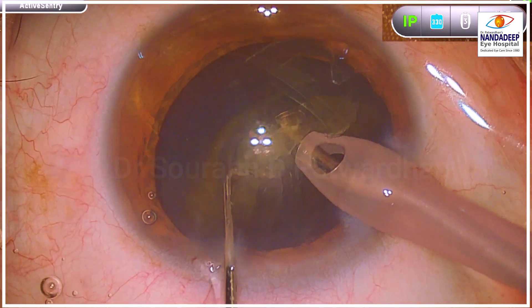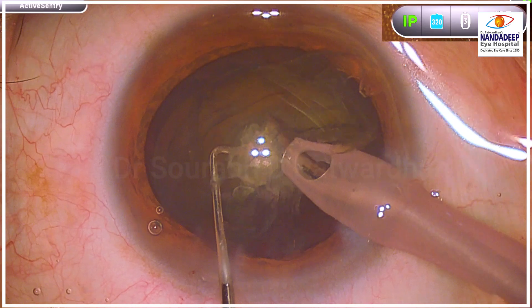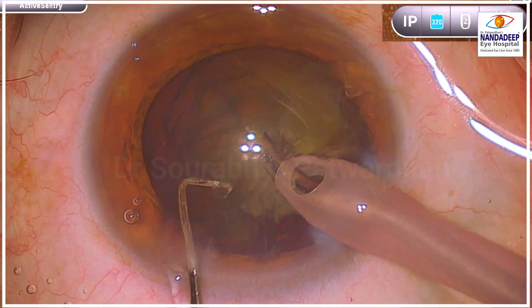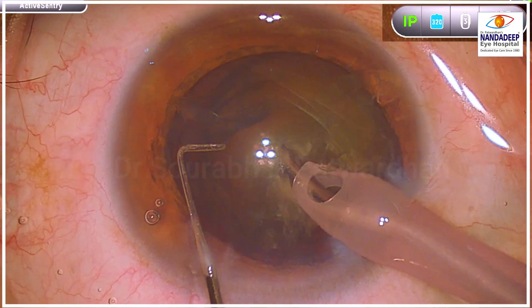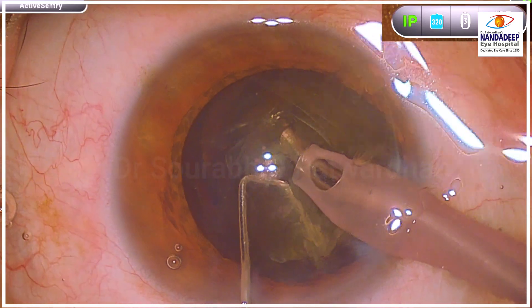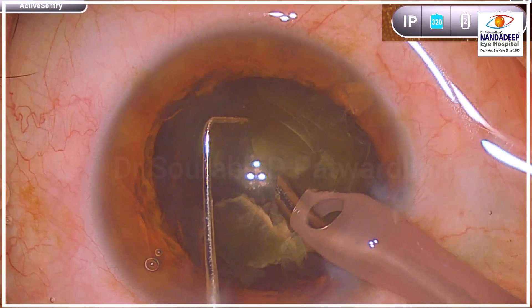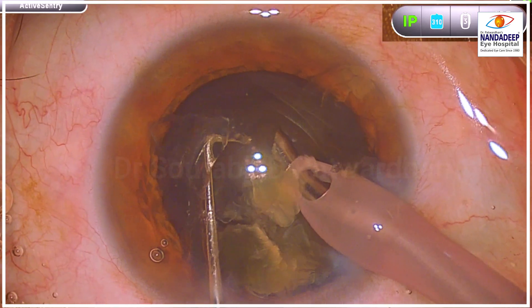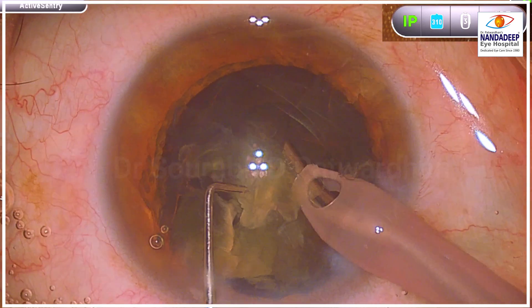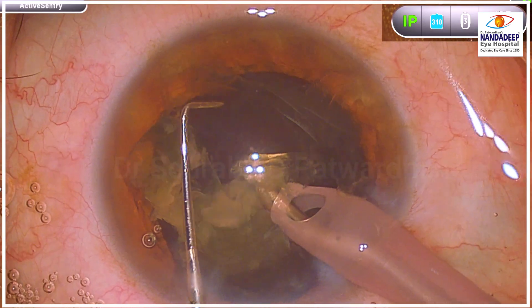The trick here is to use the energy very efficiently. The FECO is being done a little anterior to the iris margin. And if you note on the right top hand side, you can see the CDE, which is indicating how much energy I am using during the FECO — and you can see I am using it very judiciously. My FECO tip is right at the center most of the time, and I am attacking the periphery of this nucleus.